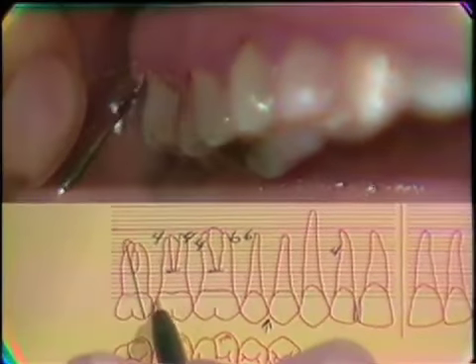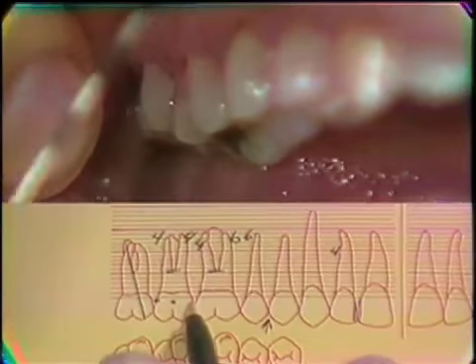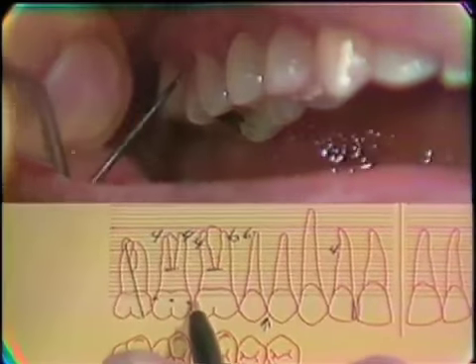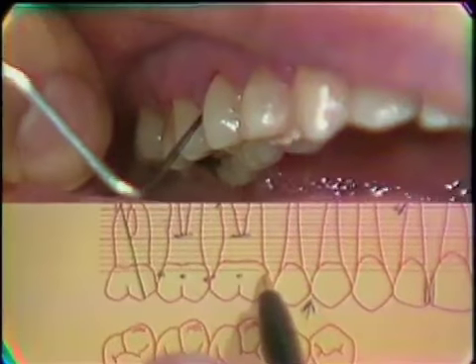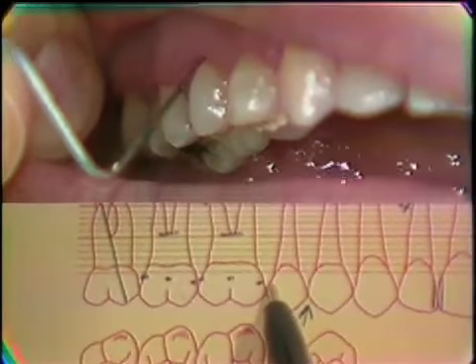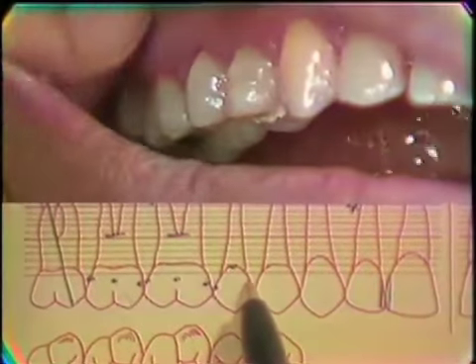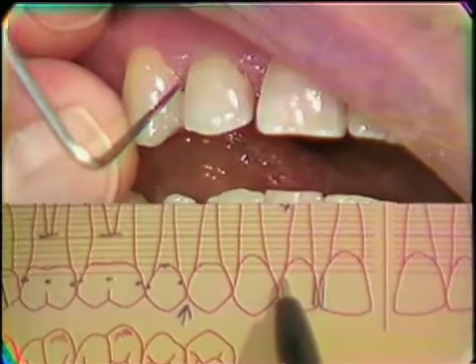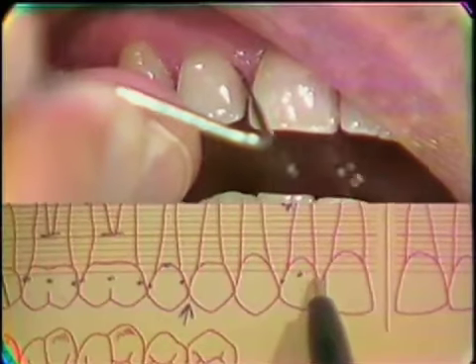Two, 2, 3. Tooth number 3. 2, 2, 3. Tooth number 4. 3, 0, 2. Tooth number 7. 2, 2, 2.